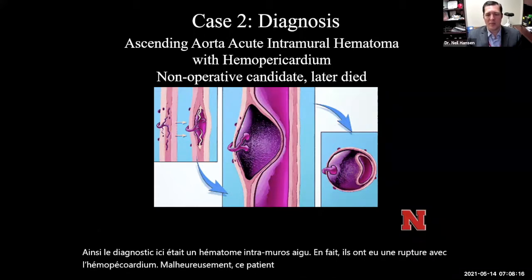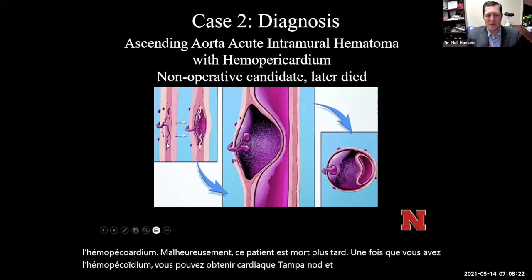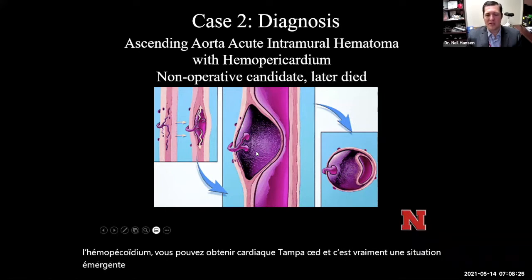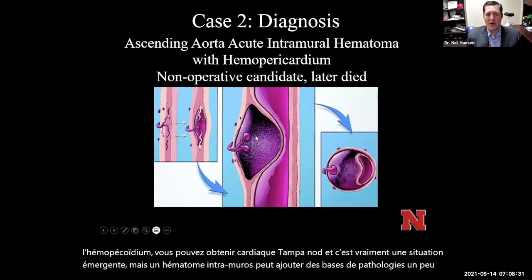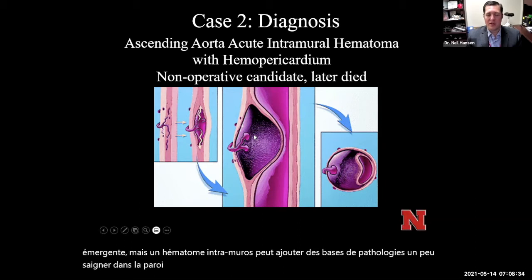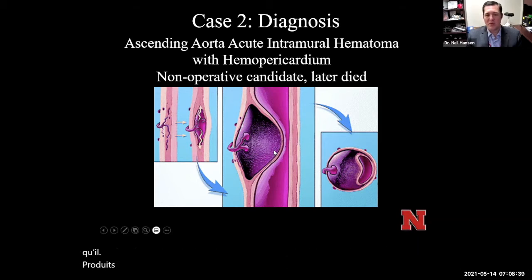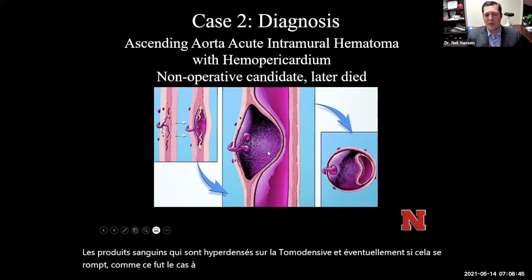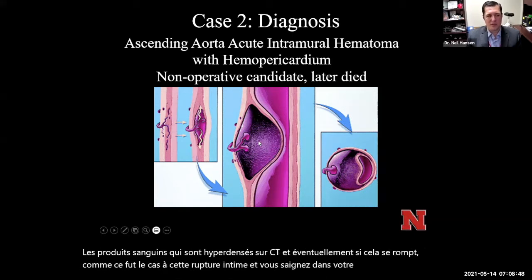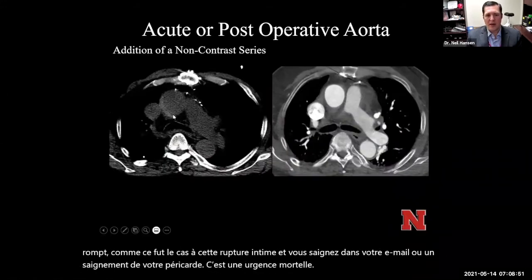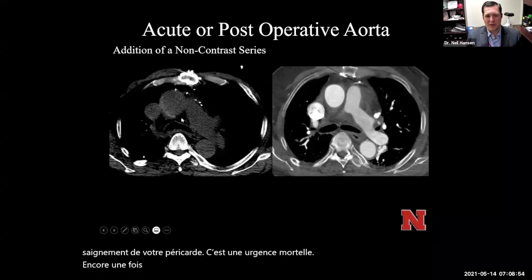Scrolling through the non-contrast images, you can see in the distal ascending aorta near the arch where it kind of starts and extends all the way down to the aortic root and the sinotubular junction. The diagnosis was an acute intramural hematoma with some rupture causing hemopericardium. Unfortunately this patient later died — once you have hemopericardium, you can get cardiac tamponade and it's a real emergency. An intramural hematoma at its basics is a bleed into the wall of the aorta, causing that high-attenuation thickening because blood products are hyperdense on CT. These intramural hematomas are a lot easier to see on non-contrast than on the post-contrast arterial phase.